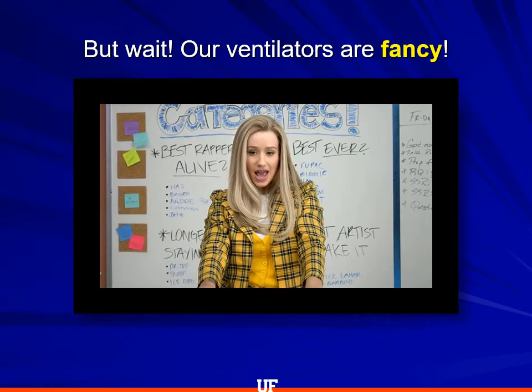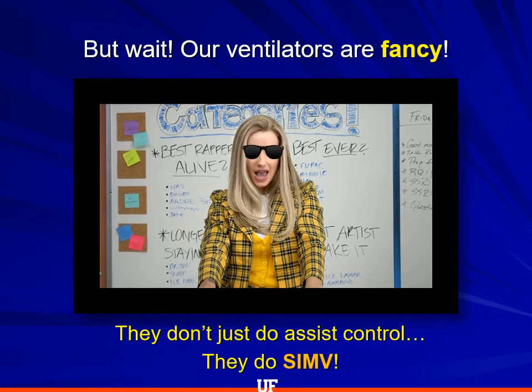Now, for extra credit, if you're especially savvy, you may be saying, but Dr. Jones, our ventilators are fancy. They don't just do assist control, they do a mode called SIMV. But what's cool is if you use all of the same principles I've taught you for assist control, you can run SIMV exactly the same way.